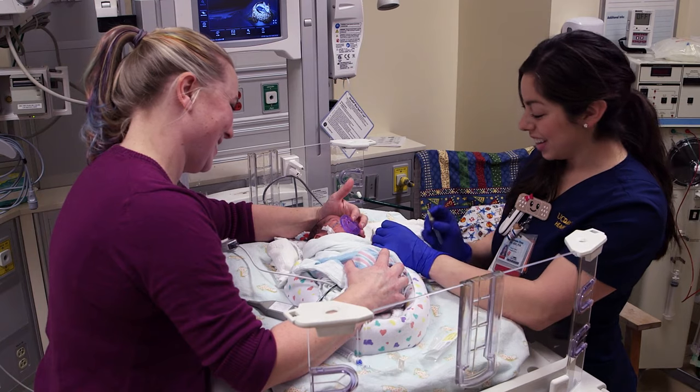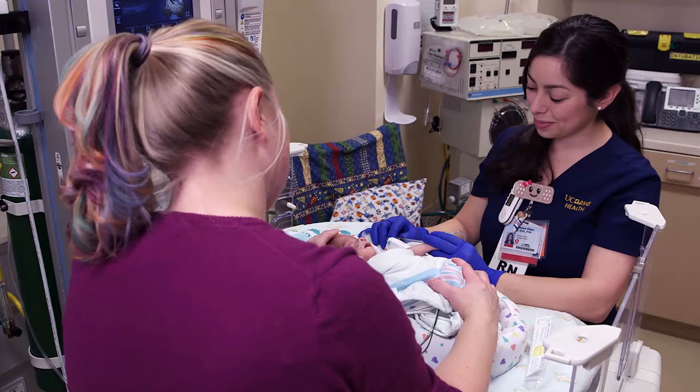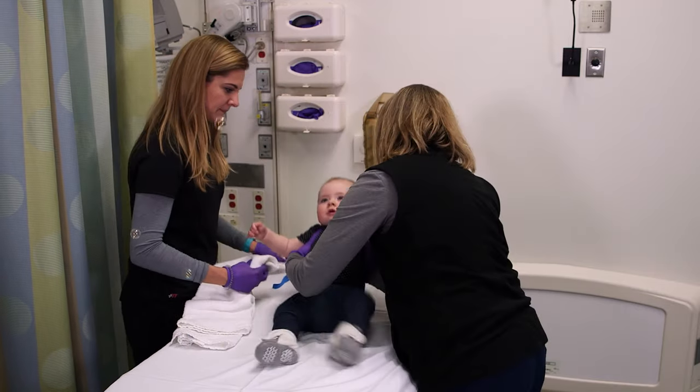When it comes to placing IVs in infants, you may face some unique challenges. In this video, we'll provide you with helpful strategies for starting IVs in our youngest patients.